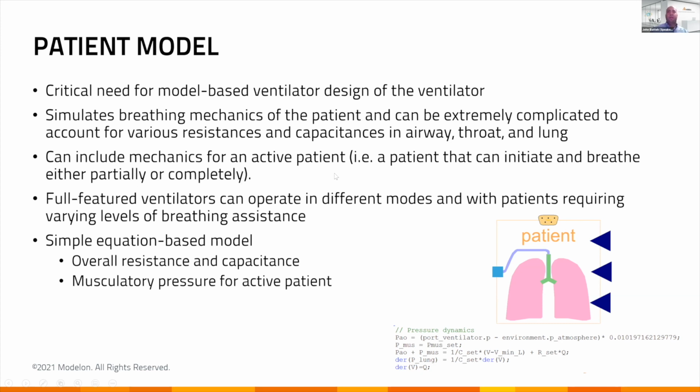So full-featured ventilators not only need to work for patients that are passive, in other words, they're not breathing at all, but they also need to work appropriately with active patients who can partially breathe, in which case you need to trigger the exhale event based on what you see from the patient side. So the patient model is extremely important because of all the different modes that the ventilator needs to operate in. And obviously we want to be able to run the model in those same modes.